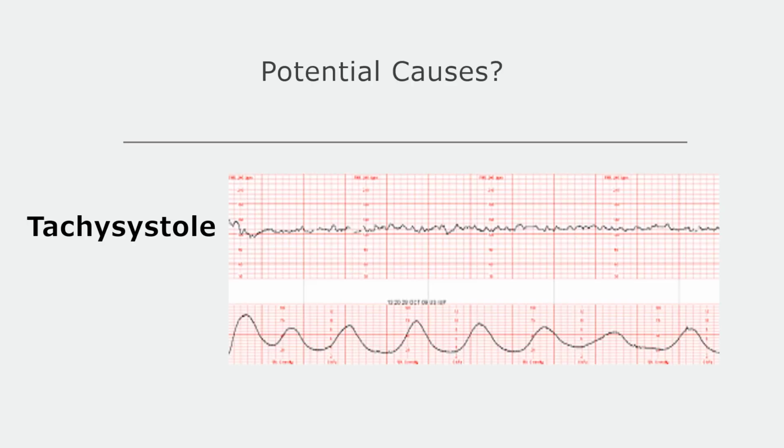Now, this is showing you tachysystole, okay? We talked about the potential causes. Okay, what if a patient comes into the unit and she's just doing this on her own, okay? She is having a lot of contractions and it looks like she's on Pitocin, but she's not, okay? I can tell you this baby, without us going over interpretation yet, doesn't look terrible. It's got oxygenation. However, after some time goes by of this contraction pattern, it's not going to continue, okay, I can tell you that.